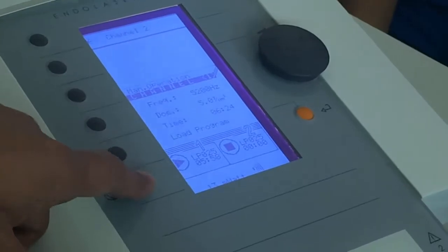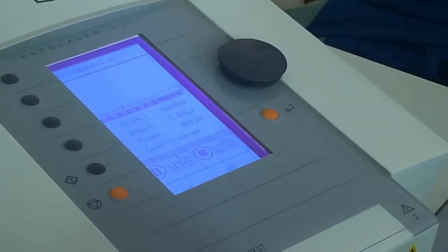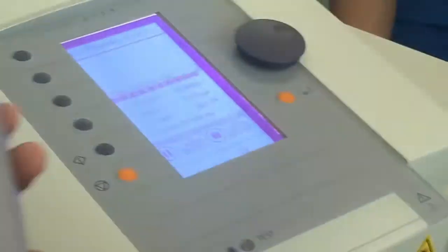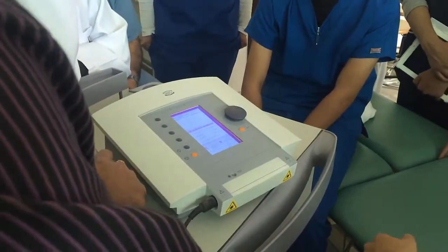Understood? Is it clear? Is 1 minute enough? Yeah, enough. Depends. Acute. Okay, it's enough. Laser is very powerful, so it will go easy. According to the automatic, I am not setting the time.